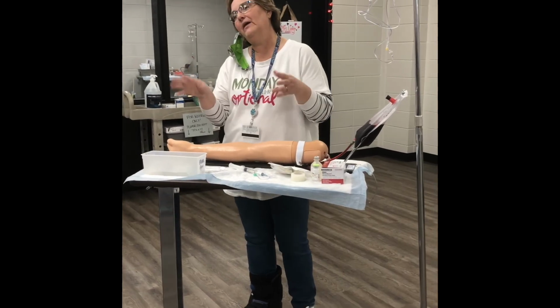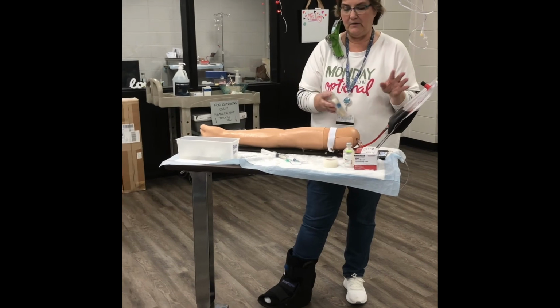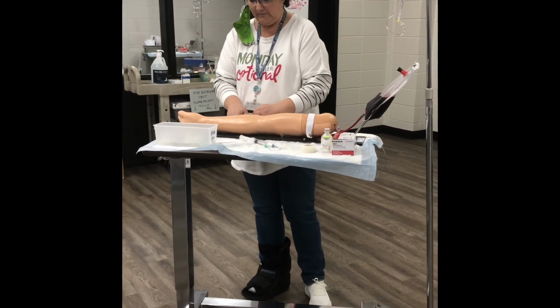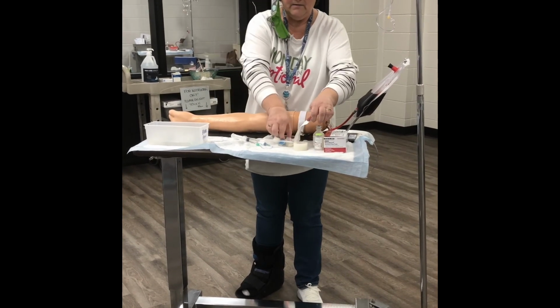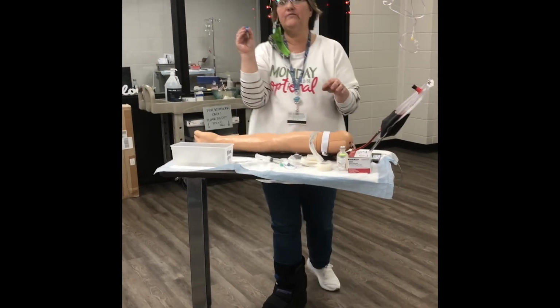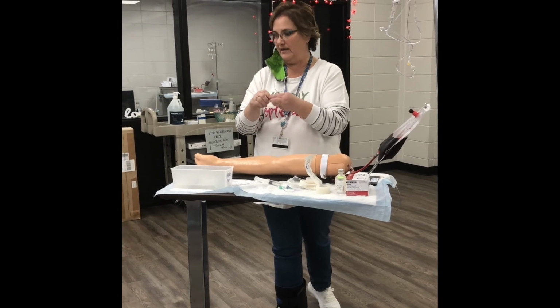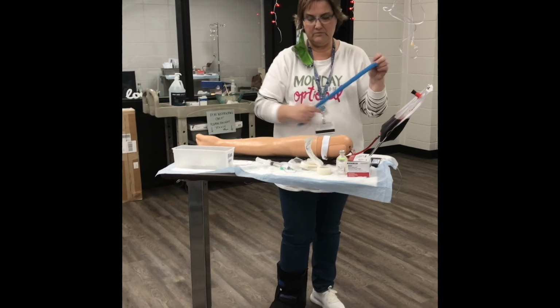So we're in the room, and we've done all the telling our patient, meeting and introducing ourselves and identifying them and all that. So I'm going to go ahead and open, because I need to pick a vein and get the arm clean. I'm going to open my kit. Your prep is right here. If you're the first one that day, there may already be a tourniquet under the arm, but if not, it's in there. So first we're just going to pick which one we're going to do.